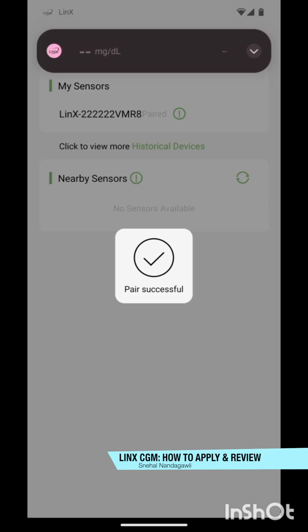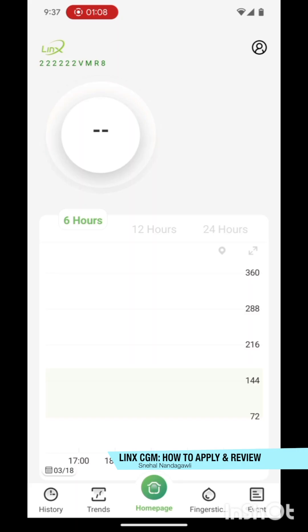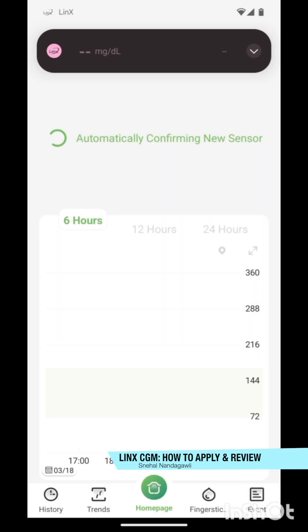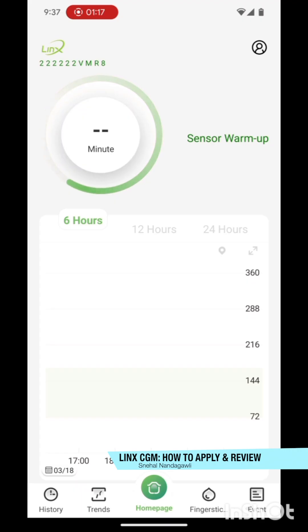It was quick — once the pairing is done, it goes into its warm-up phase which lasts around 60 minutes, one hour. Once that's done, it will start recording blood sugar readings. I've already set my blood sugar range from 70 to 170, so let's see if it gives alarms or notifications. I'll keep you guys updated and we'll see how the new LINKS CGM works.